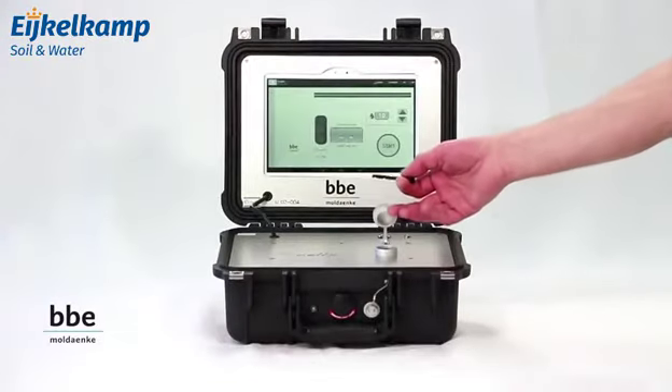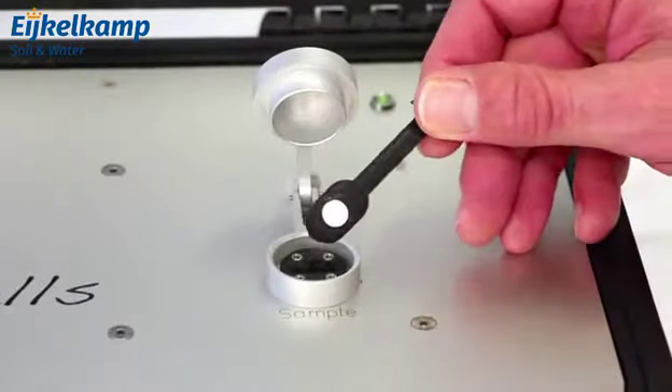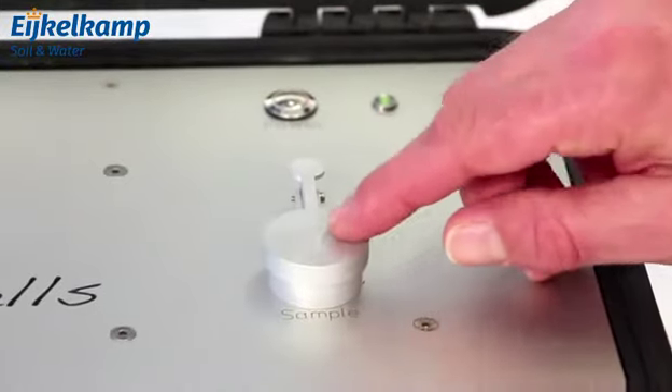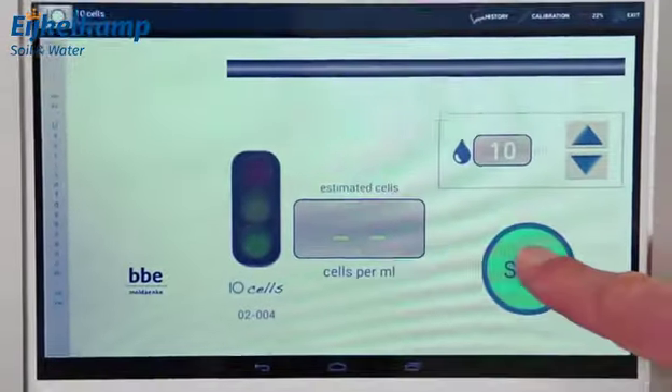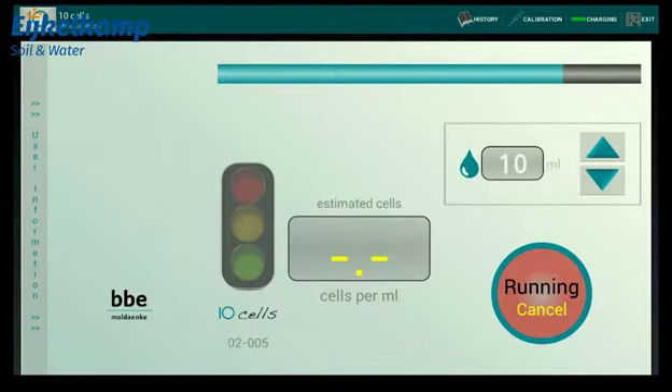Here you see the TenCells device. Insert the filter strip into the filter holder of the TenCells. Close the cap of the slot and start the measurement by pressing the start button on the display. The measurement needs approximately one minute. Then you can read the result.